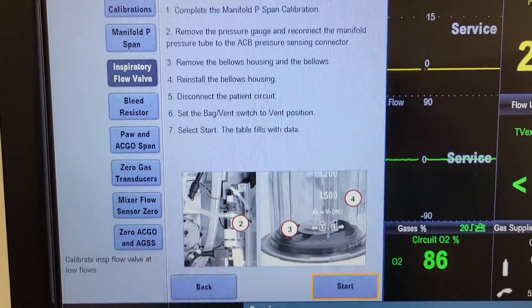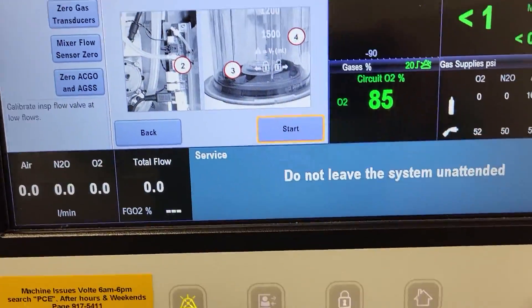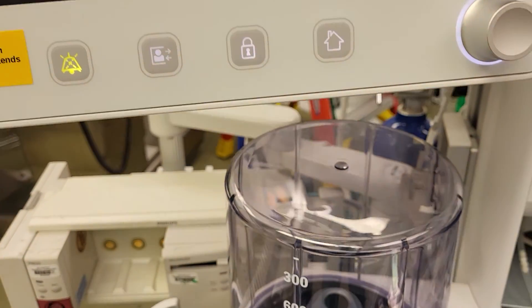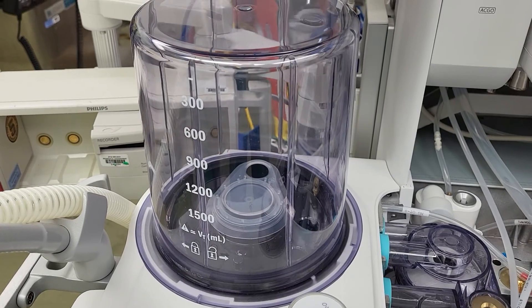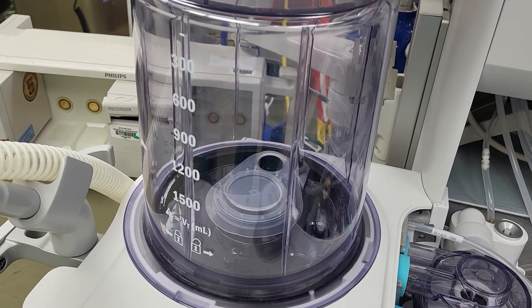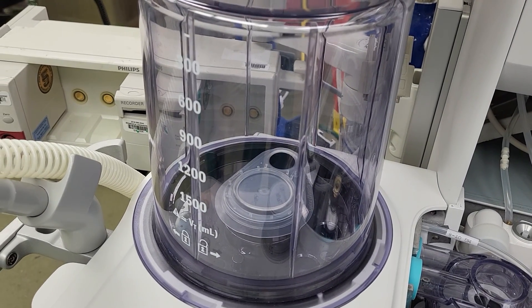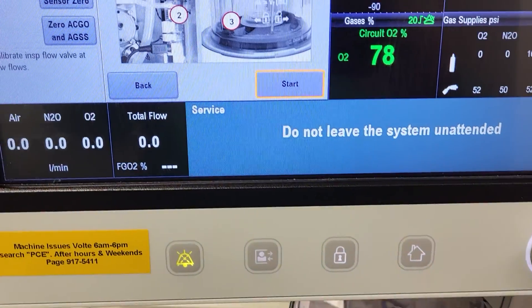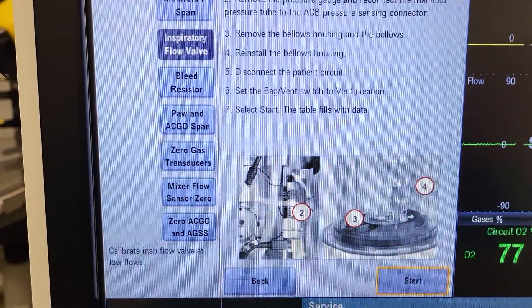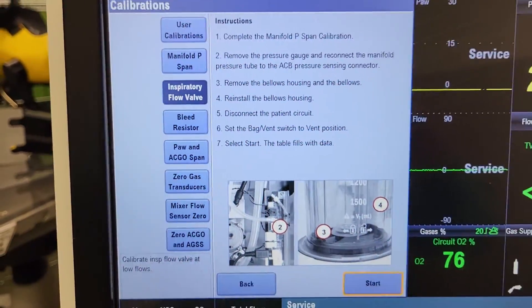Basically, we're removing the bellows — it even shows you pictures — and then going down to the bellows. We're all set up. The bellows canister is back in place; we remove the bellows. So this is step one to get set up for the inspiratory flow valve calibration.